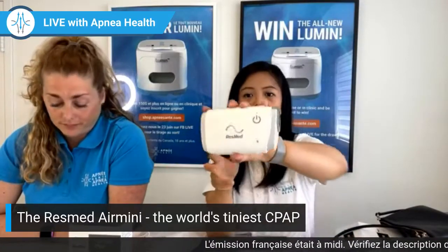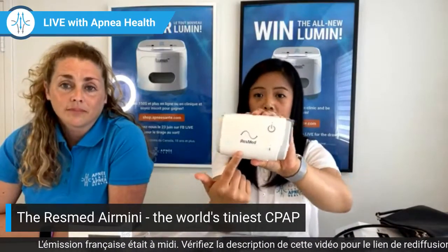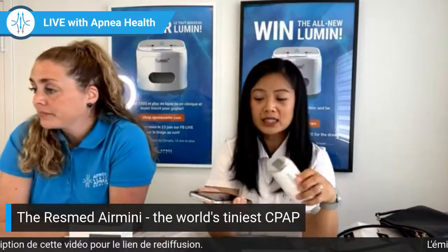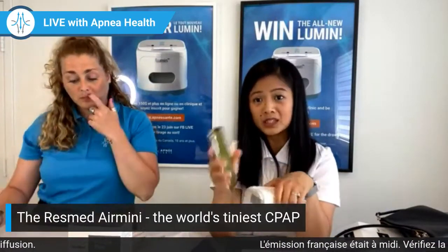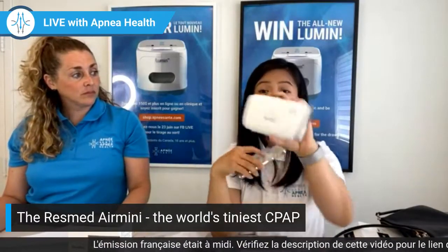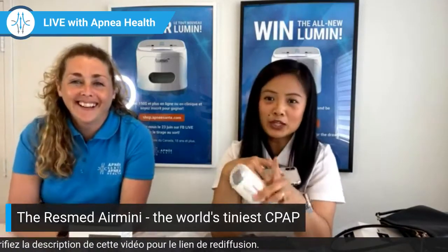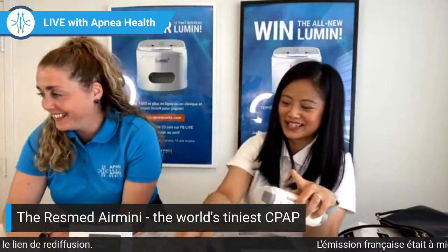And lastly, I don't know if you noticed, but there is no screen on the Airmini. That's because you need a phone, and not just any phone, you need a smartphone to access any comfort setting or even to just trend your sleep. In fact, for the clinicians who are listening, you also need a smartphone to configure your Airmini. So if you have that old Nokia, time to put that to rest.